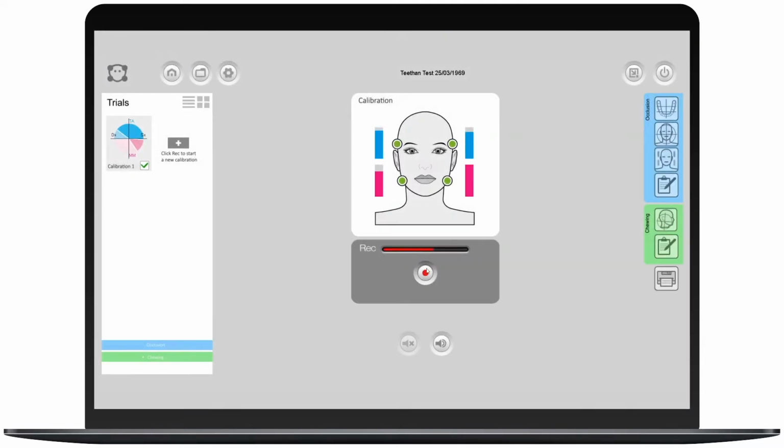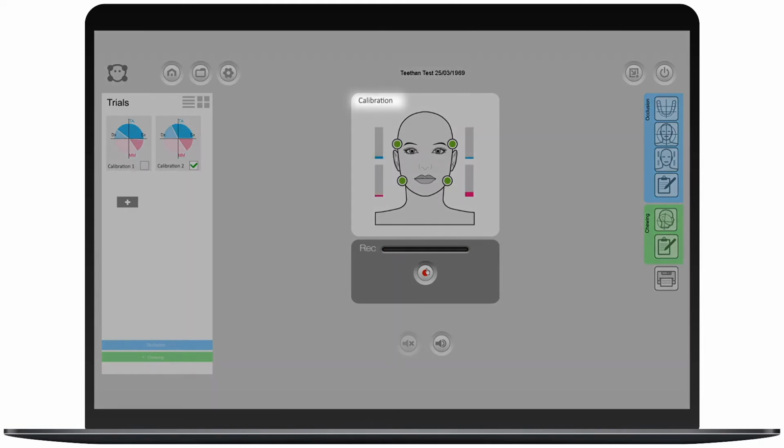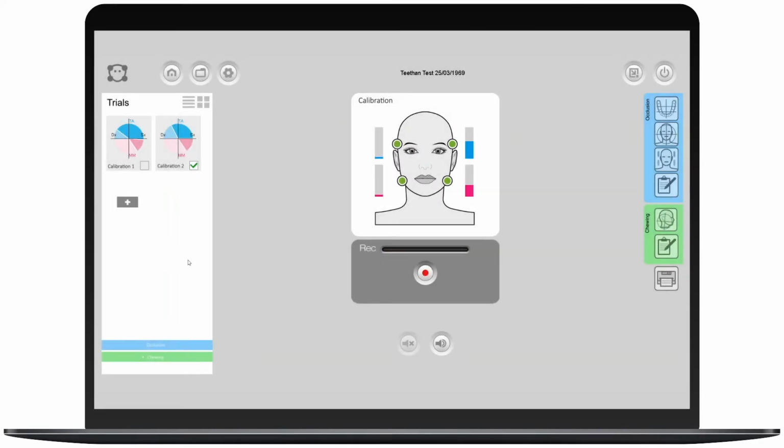At the end of the calibration test, if the previews are similar, select one of the tests and proceed with the acquisition of natural intercuspation. If the previews are quite different, repeat the calibration test again.